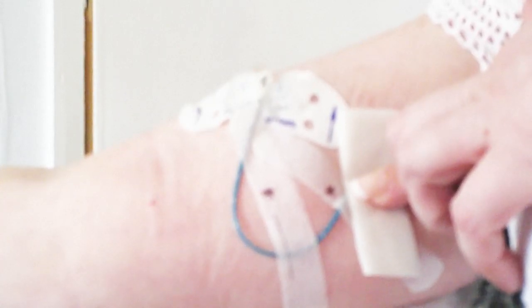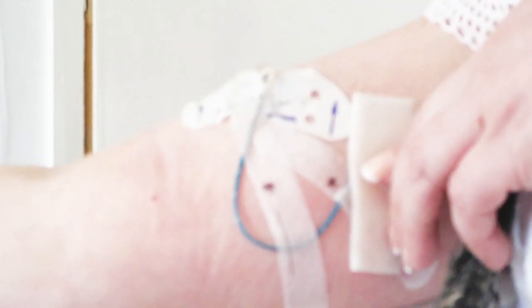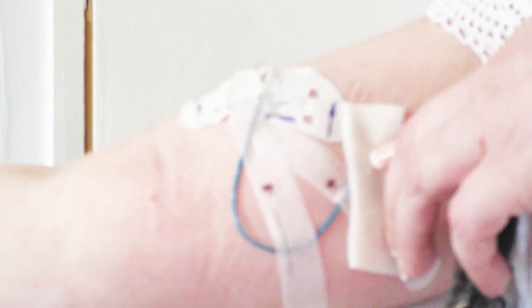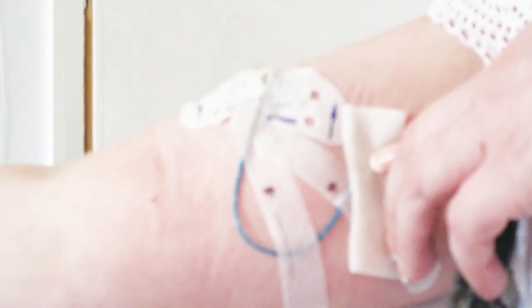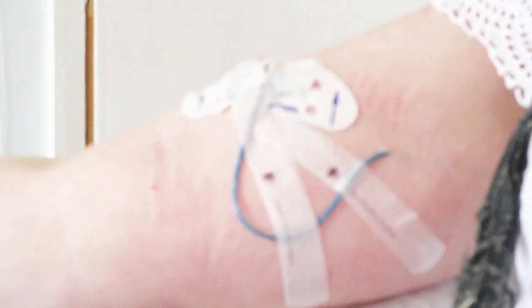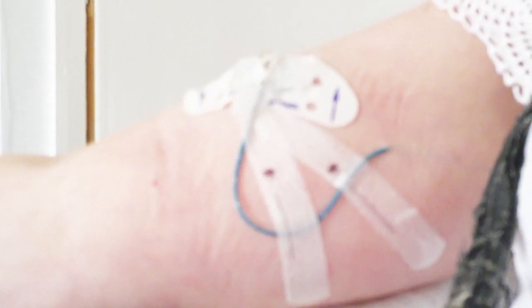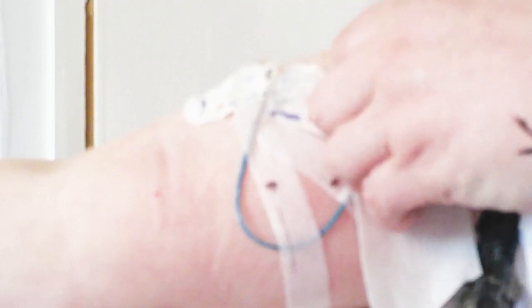Whereas with a lot of these PICC lines, you don't see much of all this bit because a lot of that is cut basically to size before they put it in. But I've just got a lot out on this one, and this one was kind of more of an emergency because I had septicemia again. So this is PICC line number 8, I believe.